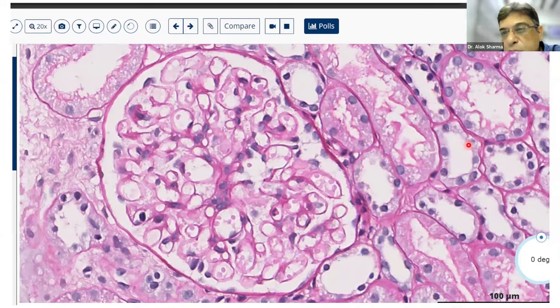So this is a cluster of distal tubules. This is a proximal tubule. This is the proximal tubule. This is a proximal tubule. Even this one is a proximal tubule, right? So it's important to identify the proximal and distal tubules because different diseases arise in the proximal tubule, the proximal tubulopathies, and proximal tubules are the site where they have better vascularity. So a lot of ischemic ATNs and tubular injuries actually predominantly affect the proximal tubules, right?